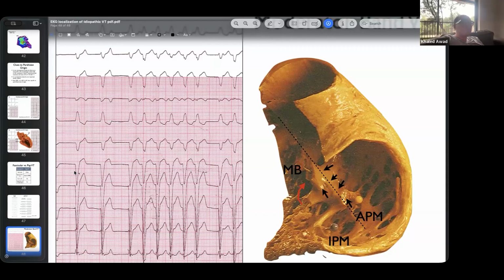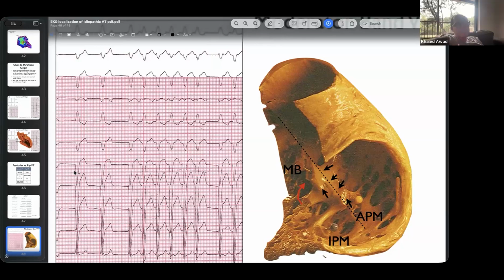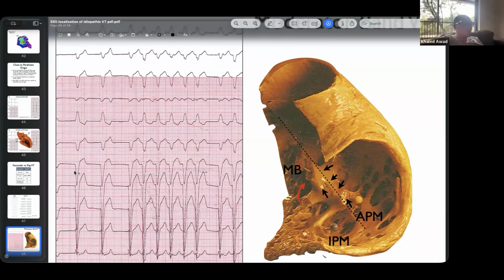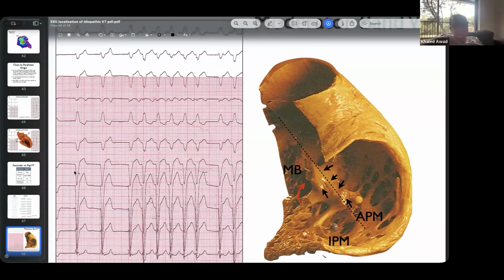That's interesting. Anytime you see a wide area of early activation, it tells you probably are not seeing the earliest. It's one of two things: or your annotation is not correct, so you have somebody who's annotating far field and near field to the same timing, so you get a very big area. Usually it also means that you're just not really getting the earliest. So let's say I have a wide area and the earliest is 20 milliseconds pre-QRS, well, that's not the earliest. And the area is very big because it's probably coming from the LVOT, okay?